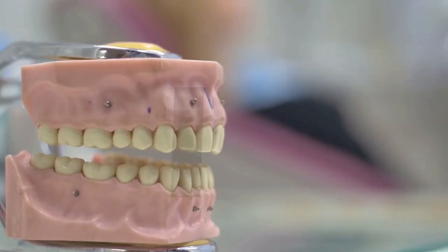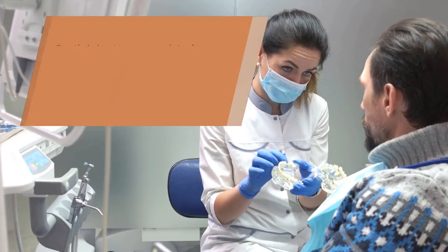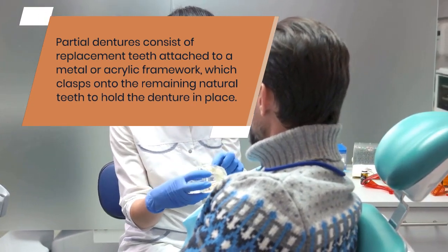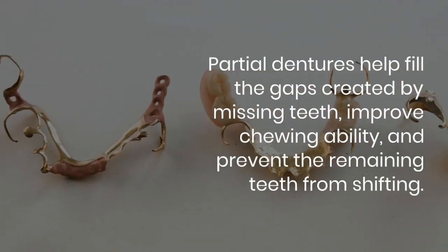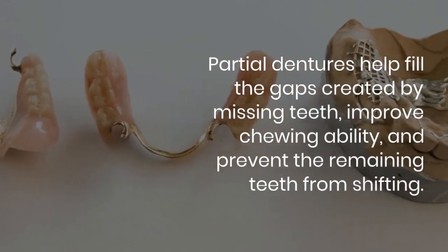and denture adhesives. Partial dentures: these are used when some natural teeth remain in the mouth. Partial dentures consist of replacement teeth attached to a metal or acrylic framework, which clasps onto the remaining natural teeth to hold the denture in place. Partial dentures help fill the gaps created by missing teeth, improve chewing ability, and prevent the remaining teeth from shifting.